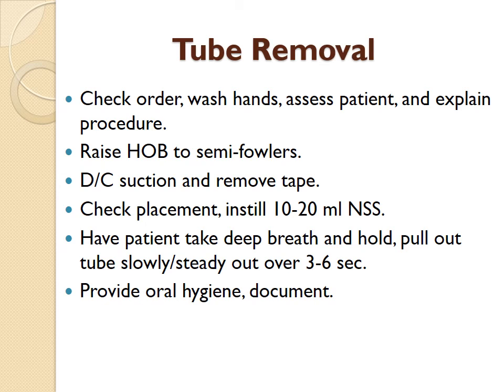Once you are giving them any kind of medication, remember, you can never instill something and then just connect it back up to suction. Critically think, all that's going to happen is the medication is going to be sucked right back out. So if the doctor wants you to give them a medication to see how they're going to handle getting this tube out, you automatically clamp the tube for at least 30 minutes to allow the medication to be absorbed. If during that time the patient complains they can't tolerate it, then you connect it back to suction and you notify the doctor.